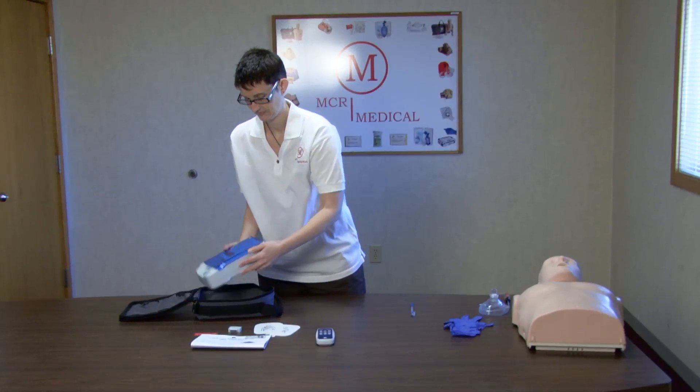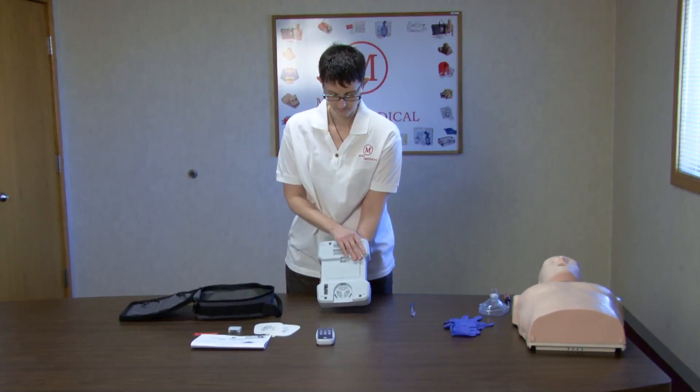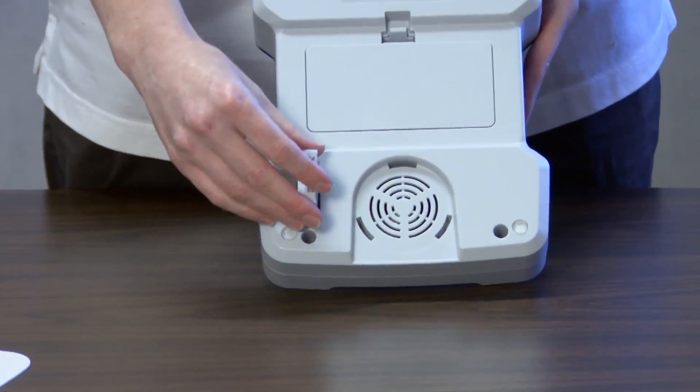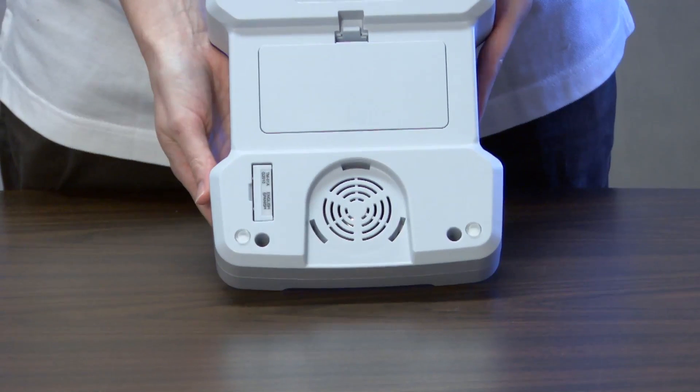Remove the Preston Professional AED Trainer from the carrying case. Lining up the notches to ensure proper installation, insert the module into the back of the unit on the lower left-hand corner by pressing firmly. When ECC guidelines change, simply replace this module.